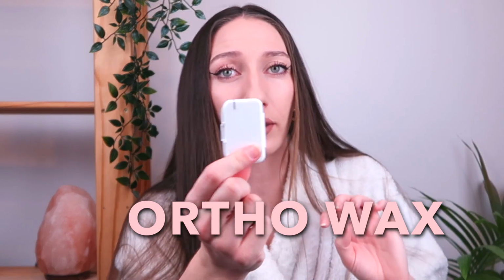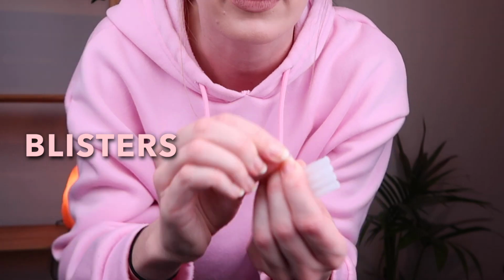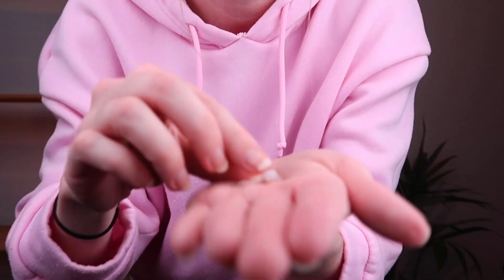Also, you're gonna have your ortho wax, which is just to stop any irritation when you bite your lip. I bit my lip last night I think, and it's really sore, so I'm putting on some of this today as well. You just put the ortho wax over your bracket where it might be rubbing off your cheeks, and then you feel that it's smoother.